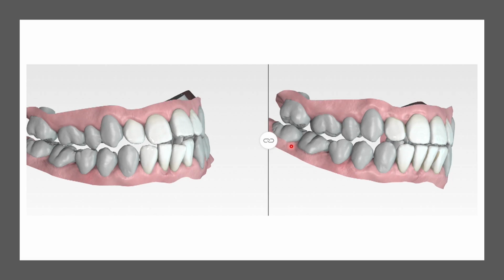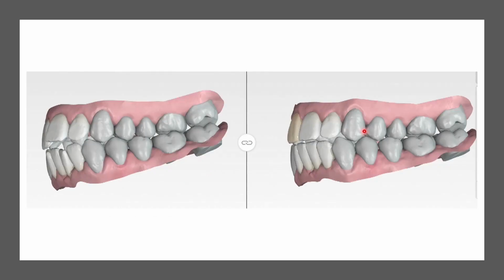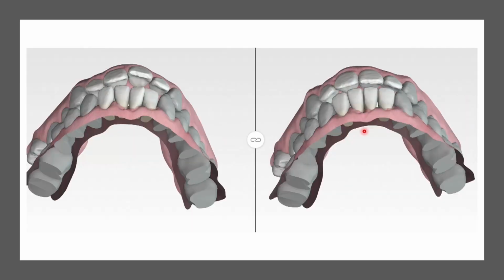By the way, this could only have been delivered with clear aligners because, of course, brackets and wires would have moved everything at the back here. And that's it. Sorry, this is a nice view. Actually, you can see the closure of that tooth down here. That there is a really simple move. This one is probably the hardest move in the whole plan. Actually, it's the rotation of this tooth here.